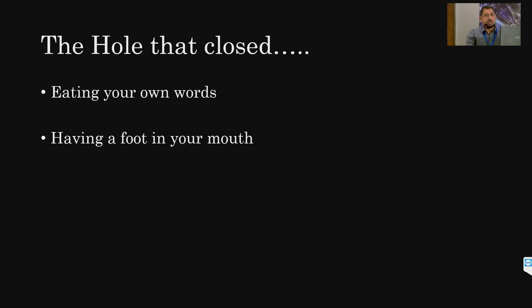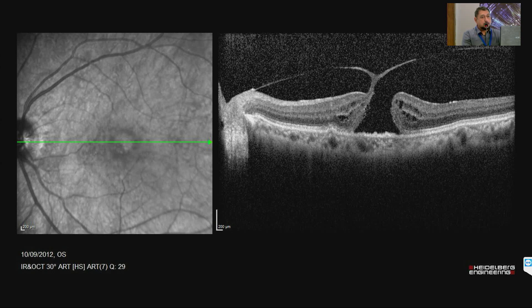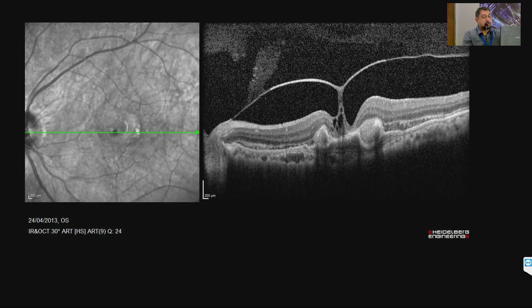Sometimes when you say the macular hole closed, they don't behave as expected. This is a macular hole with a VMT attachment — we were offering surgery. The patient didn't have surgery, subsequently developed a CNVM, and without surgery the macular hole closed because of the fibrotic reaction.